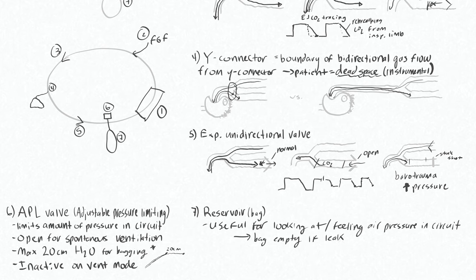If there is a leak, just take a systematic approach from the patient to your anesthetic machine and try to identify any common problems that occur. I'll just take over this drawing to list a couple of these things. Unless there's something unusual going on inside the patient, like a pneumothorax or a bronchopleural fistula with a chest tube in place, your leak is not likely inside the patient, so your next reasonable location to check is the cuff inside the endotracheal tube.